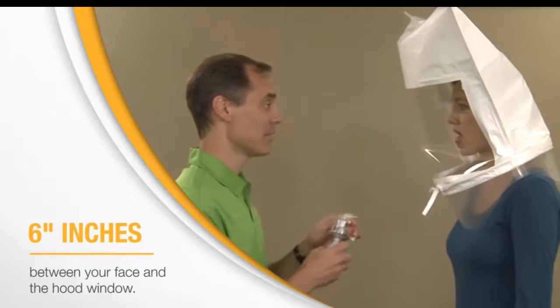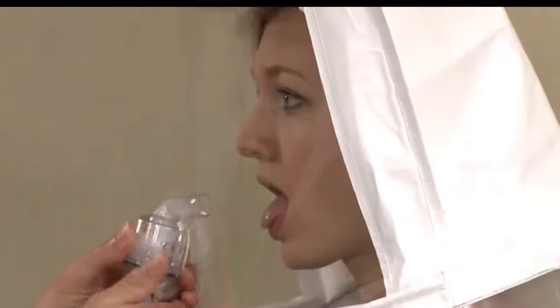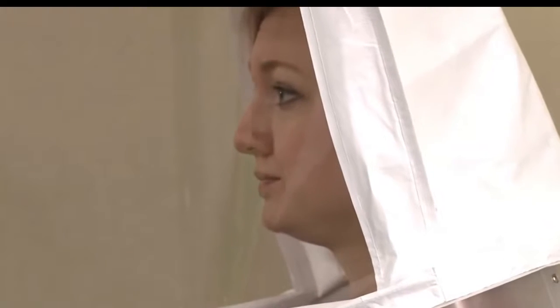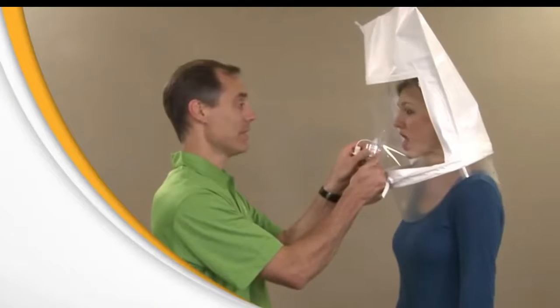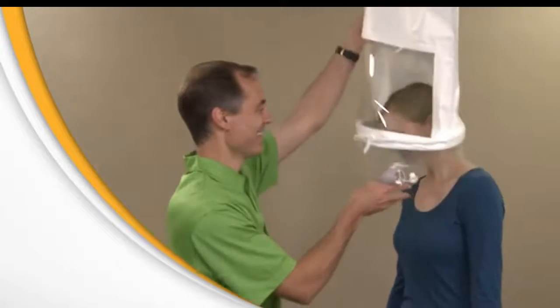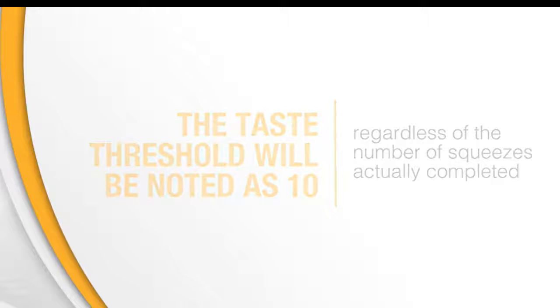Using nebulizer number 1, containing the sensitivity solution, the instructor will initially spray 10 squeezes into the hood through the hole in the window. You must breathe through your mouth and extend your tongue slightly. If you taste the test agent at any time during the 10 squeezes, tell the instructor. The taste threshold will be noted as 10, regardless of the number of squeezes actually completed.